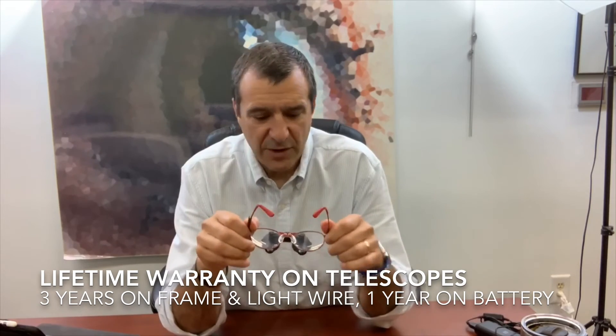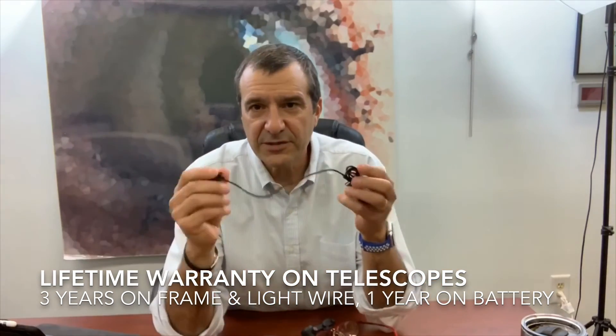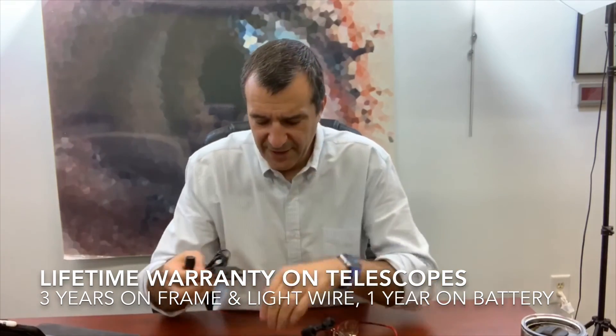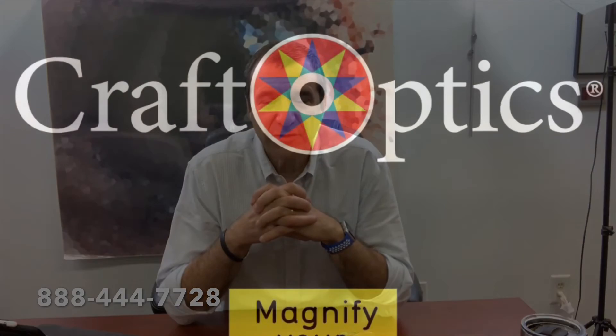The magnifying telescopes and hinge have a lifetime warranty. The titanium frame has a three-year warranty, as does the Dream Beam light and wire. There's a one-year warranty on the rechargeable battery. If you have any questions, give us a call at 888-444-7728.